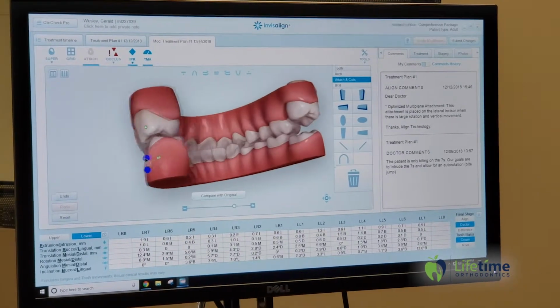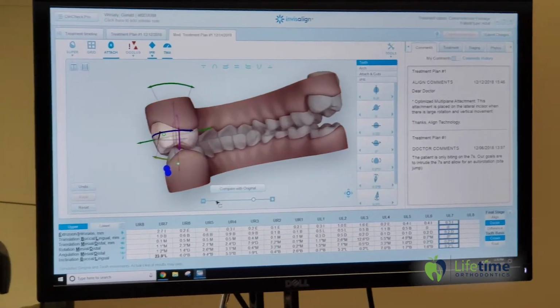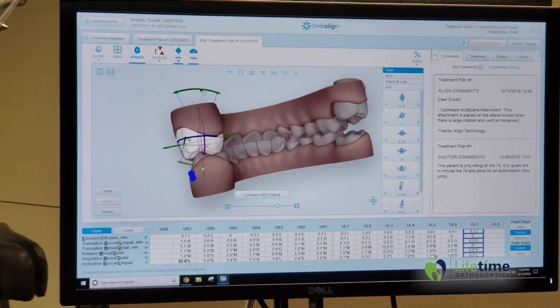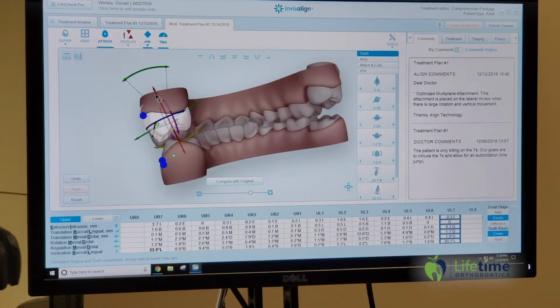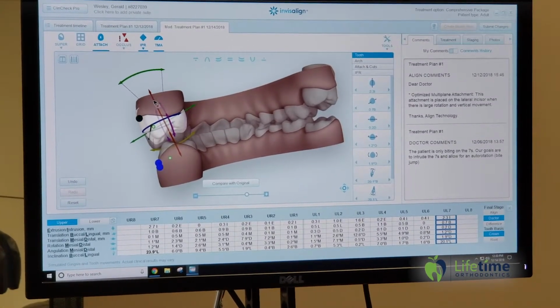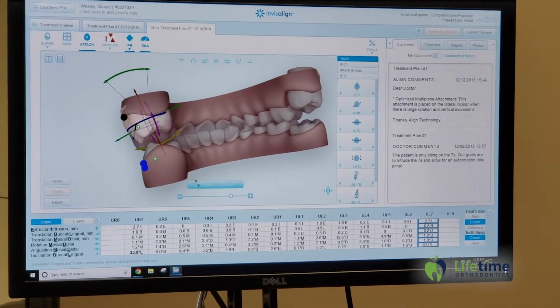All right. And I'm going to go over here, I'm going to do the same thing, because I can see this tooth. We're going to go back to tooth, we can see I want to get this tooth out of the way. So I'm going to push that all the way, and I'm going to intrude that about 2.5 millimeters. 2.3, 2.5, 2.7. There we go, pretty close.